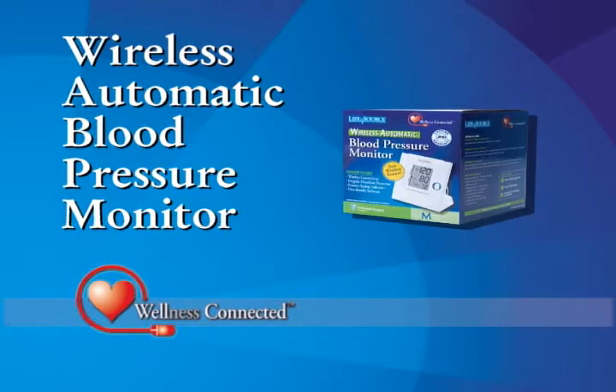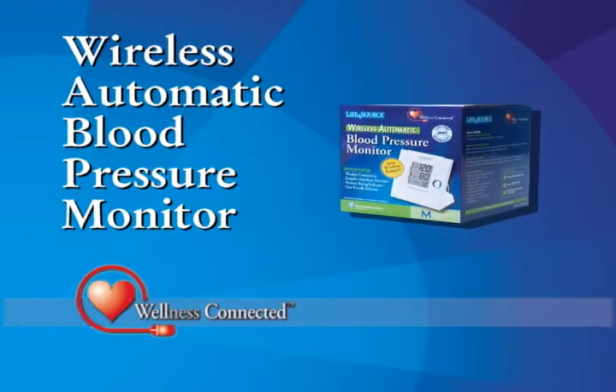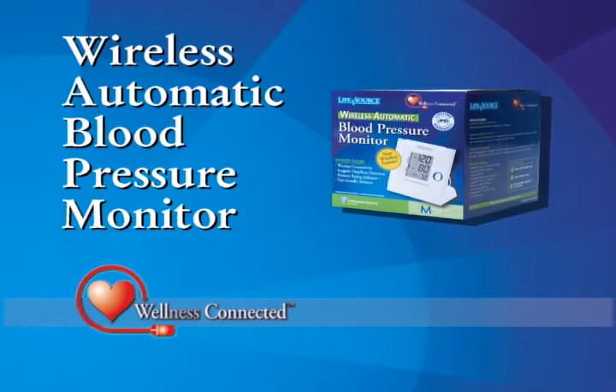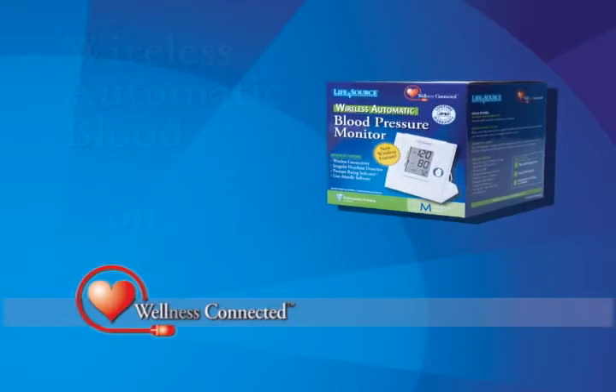Combining a portable blood pressure reader with easy-to-use software, the Wellness Connected Automatic Blood Pressure Monitor simplifies keeping up with your blood pressure readings daily as you work towards your goals.